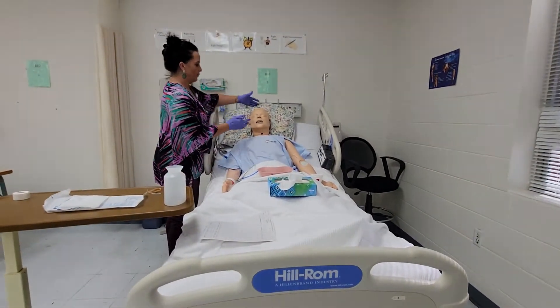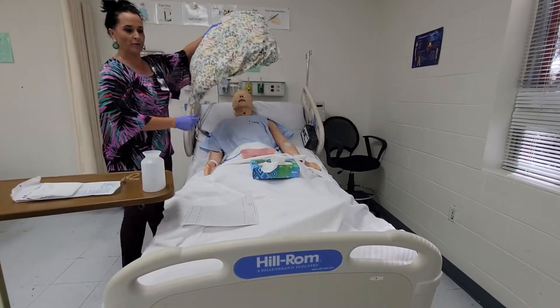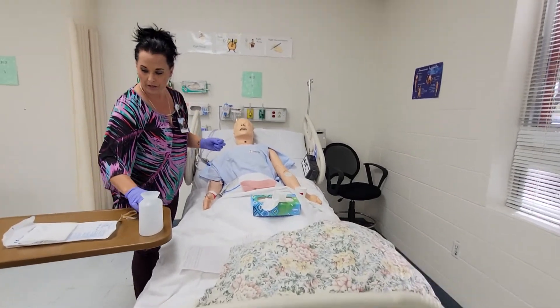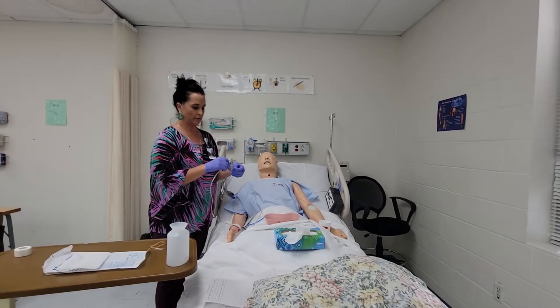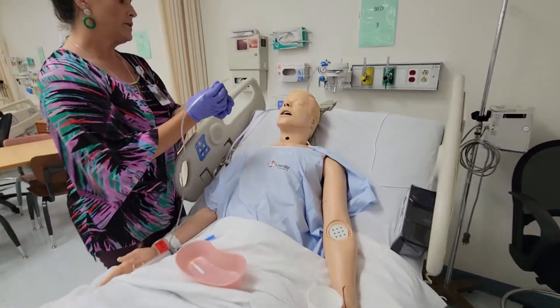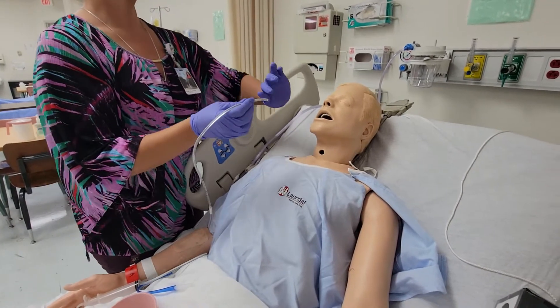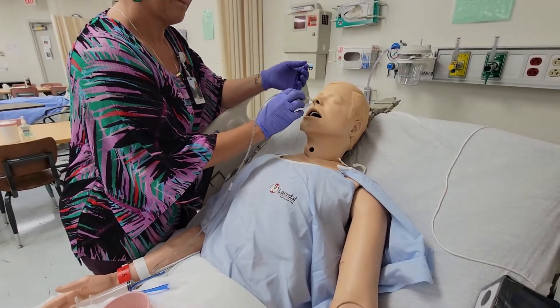You always want to start with your patient's neck hyperextended, so we're going to remove the pillow. I'll take my lubrication — you can just put it into the little package there. We said he breathes better out of the right side, so his neck is hyperextended and I'm going to gradually start introducing it.